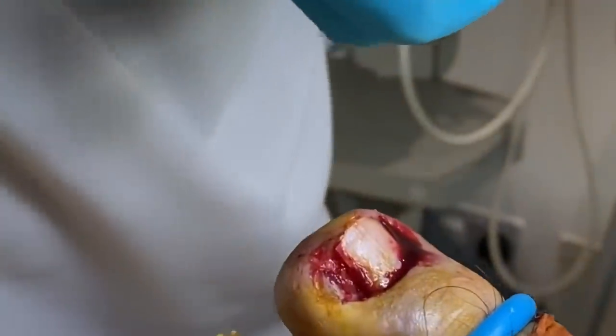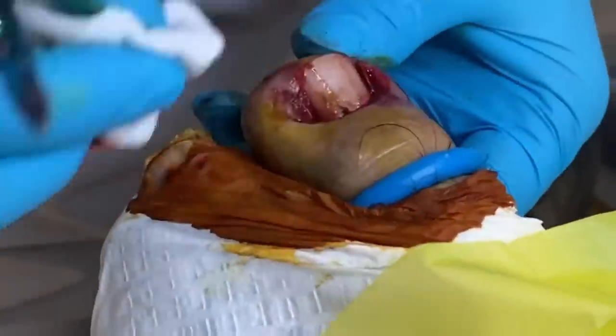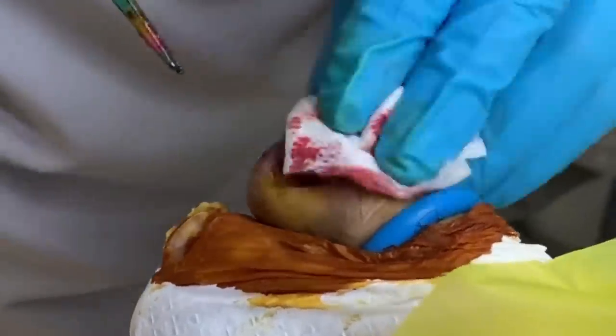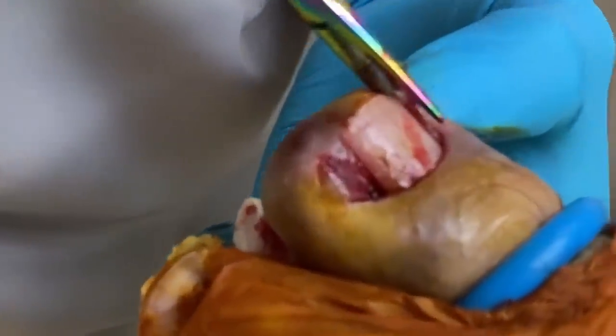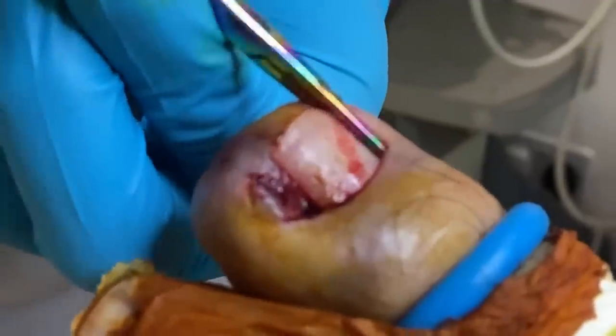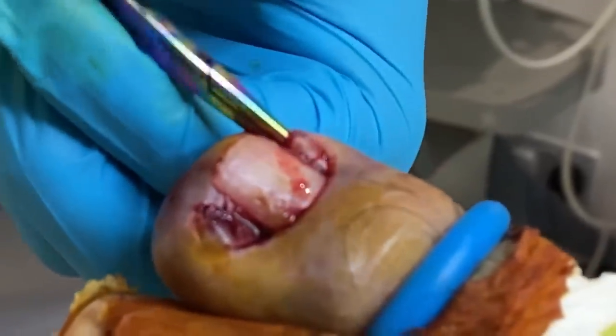Look at that — that is bad. You see where this has been building up? This is all tissue that needs to come out, otherwise it will cause a massive problem later on. I'm going to take this side out.